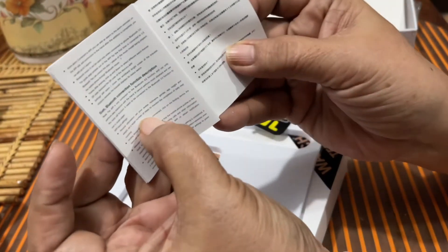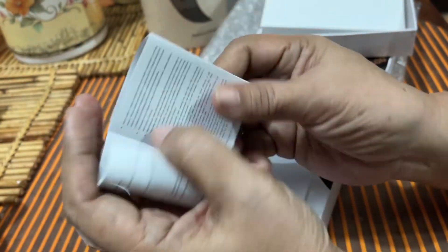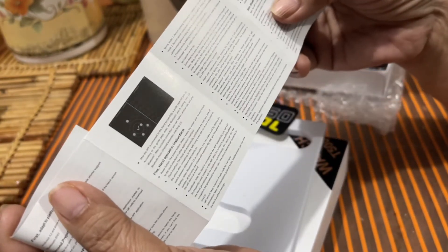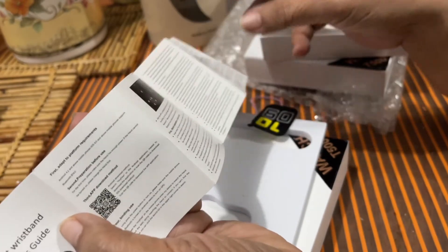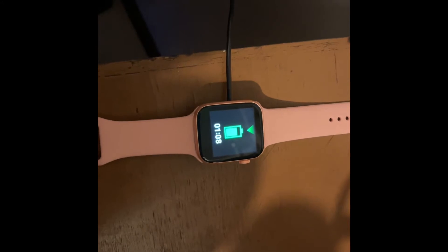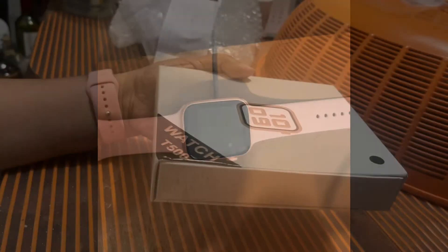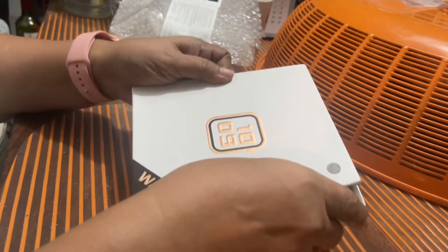Kakalimutan ko na nga pala yan. Binabasa ko na yung mga nakalagay — sobrang liliit naman po ng pagkakasulat, Diyos ko. Kailangan mo pang picturean, tapos i-blow up para mabasa mo kung ano yung sinasabi. Sabi, madali lang daw i-charge. Pero ito, inabot ng dalawang oras. So mamaya susubukan ko rin yung sa asawa ko — titignan ko kung ilang oras din aabotin.